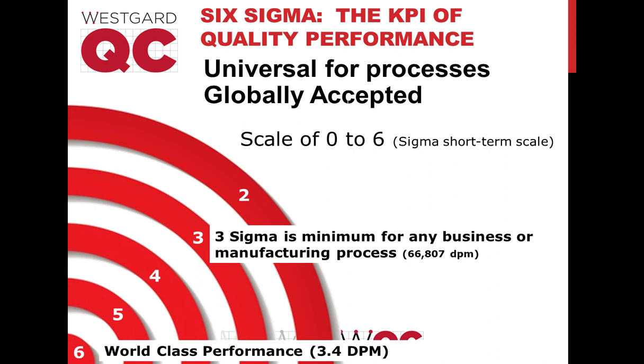But as we get a new data point, if we merge that information with the previous 3, 6, or 12 samples that came in over the past year, we could get a little more confidence about the bias that we're seeing. So we could get the individual bias percentages and average them all together. Maybe that's not the most ideal way to determine your bias, but it is giving you a long-term assessment and an overall assessment of the bias that you're trying to determine.